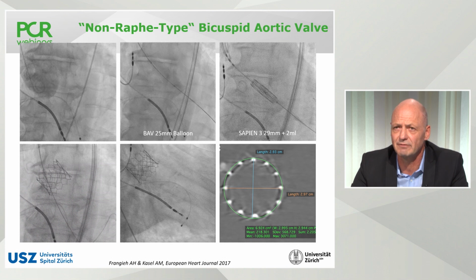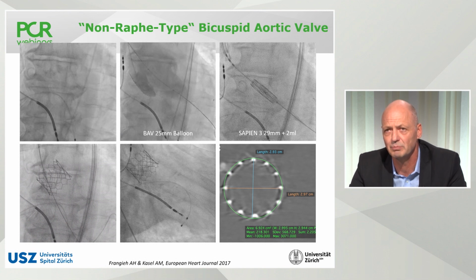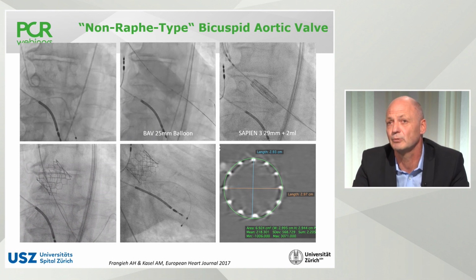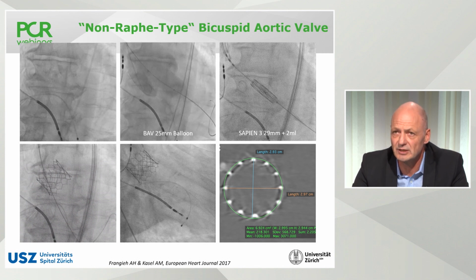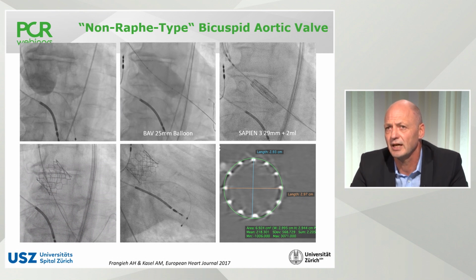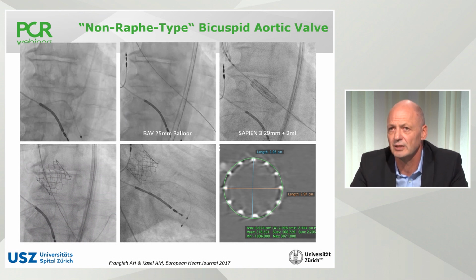What we see first is that the balloon stays in the middle and does not shift to one side. Sometimes the impact of calcification, especially when it is asymmetric, is that the balloon and also the valve shifts to a weaker side and can cause an injury there. And with the balloon, we also see there is no influence on the coronary arteries. So it gives us some idea of the impact of the calcification and how the anatomy is.